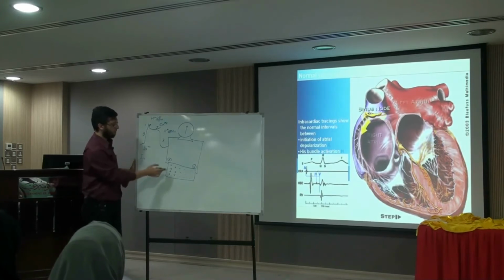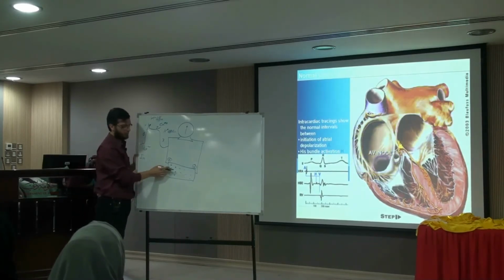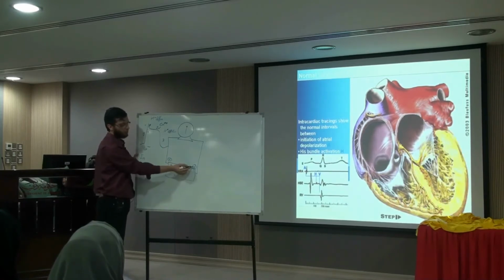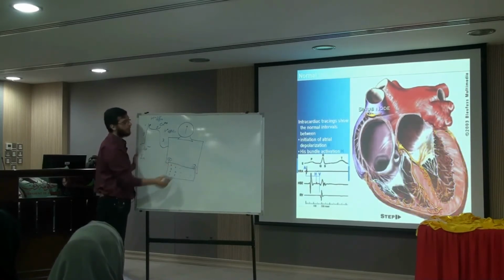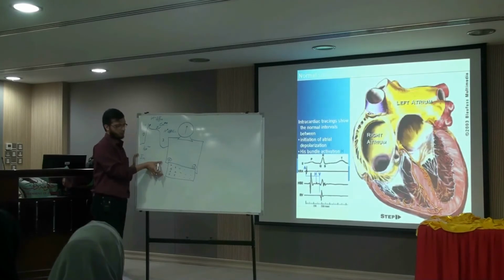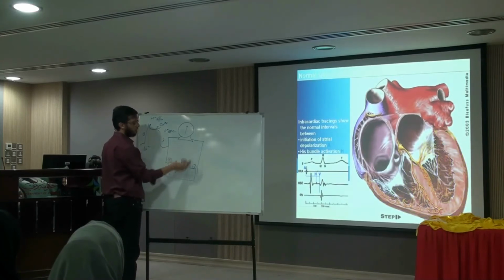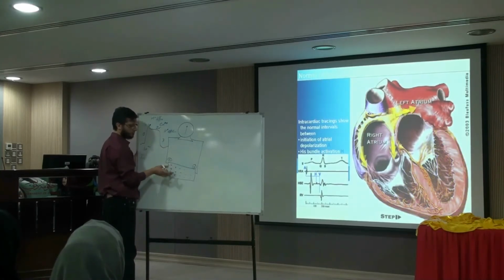All right. So if the depolarization is going in this direction, positive, positive, positive, the positivity is going towards the positive, and this tissue has this thickness, so the voltage will be this amount, with the positive towards the positive.